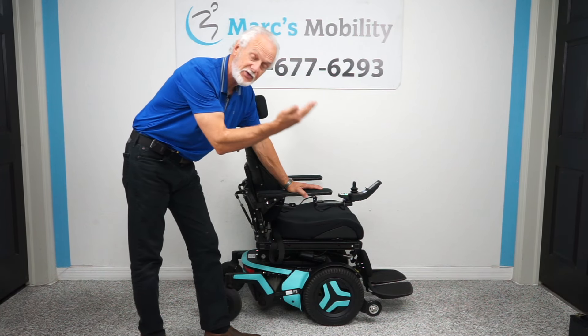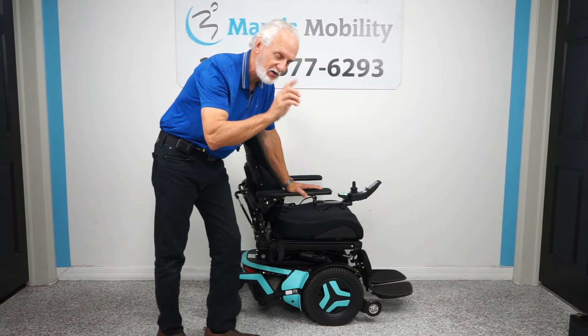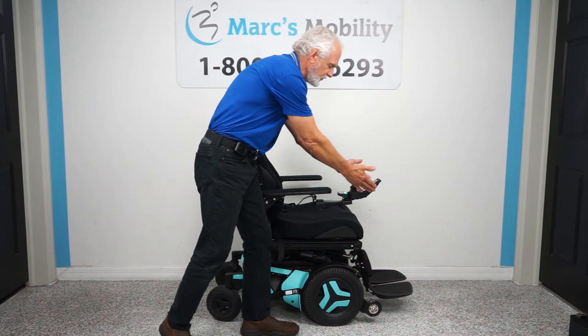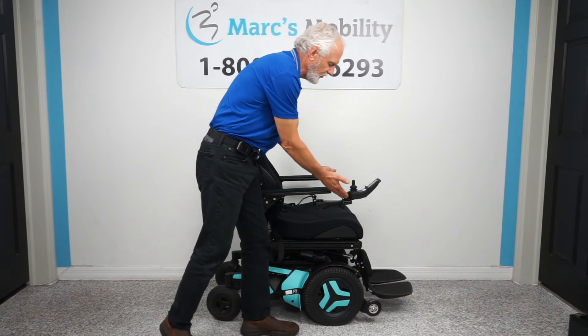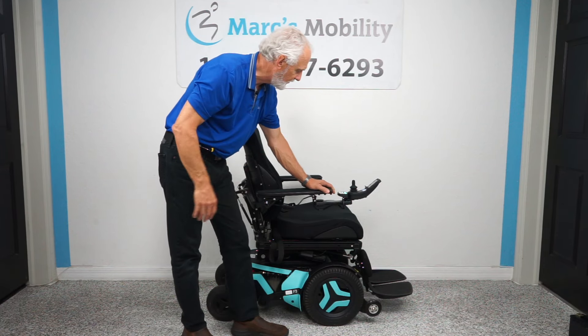It has five functions: the 12-inch seat lift, the electric tilt, the electric recline, the electric feet, and it also has the interior tilt. You can work all the functions on this chair through the joystick, or you can also do it through the switch box. I like to use the switch box — it's quicker for me when doing a video.